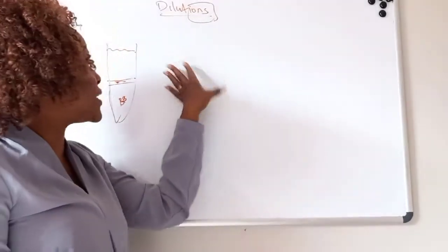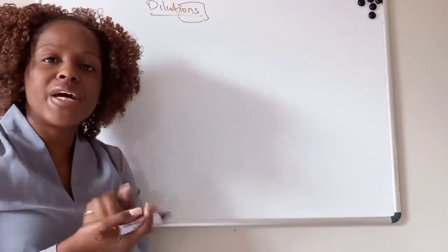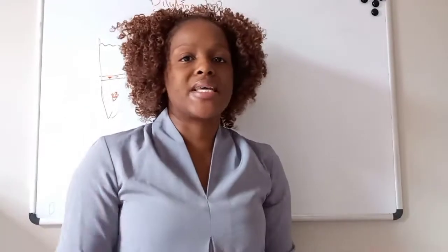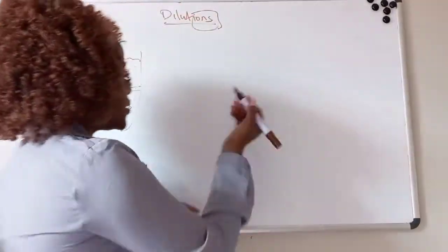You have to determine how much serum is there in your patient sample, so that you can determine the volumes that you need to use. Let's say the SOP in your lab says when the beta HCG result comes out as greater than, you have to do, let's say, a 1 in 5 dilution.